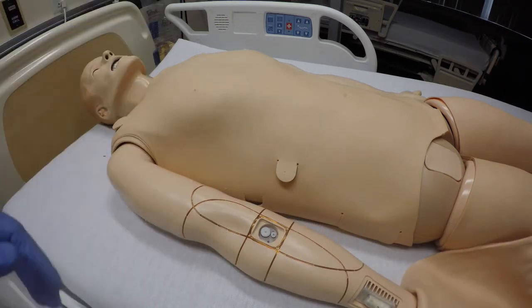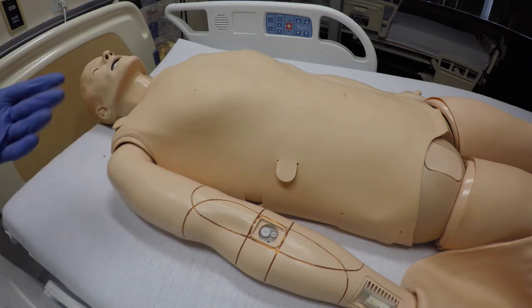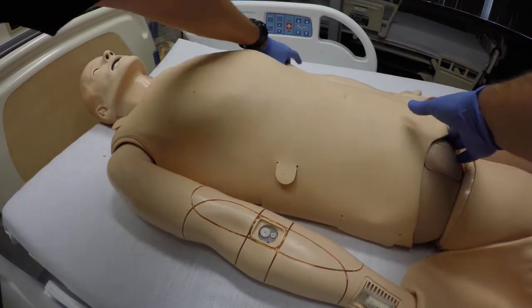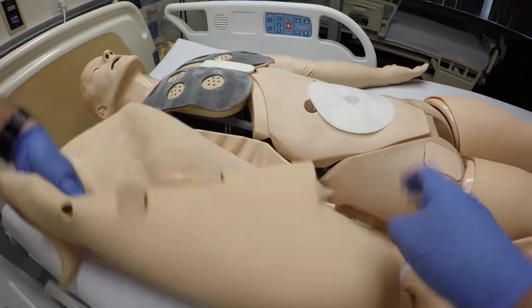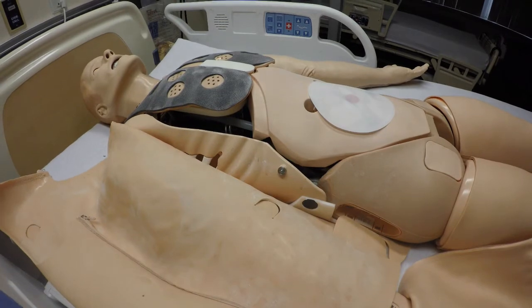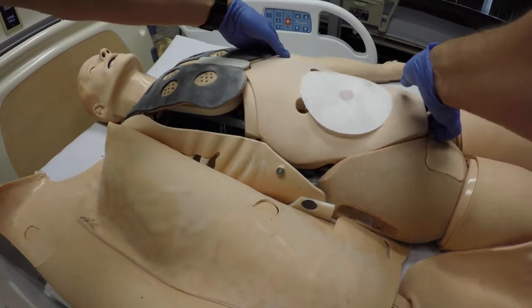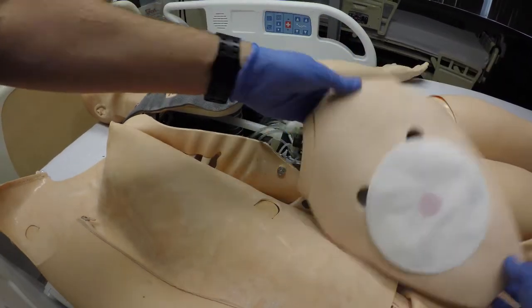First thing you want to do is unzip the skin on either side. Some of the newer versions of the skins have zippers on both sides — that's fine. Let's undo the zipper here and move the skin over. Next, we're going to want to remove the abdominal plate — lift this up from the Velcro and slide it to the side.